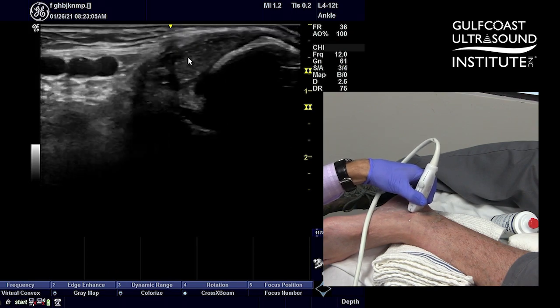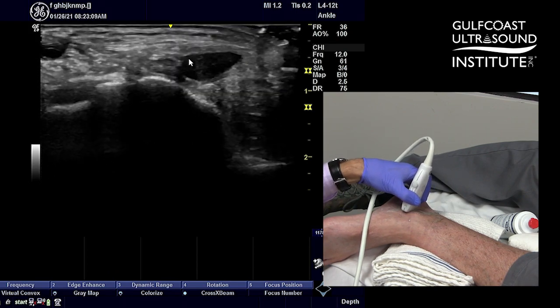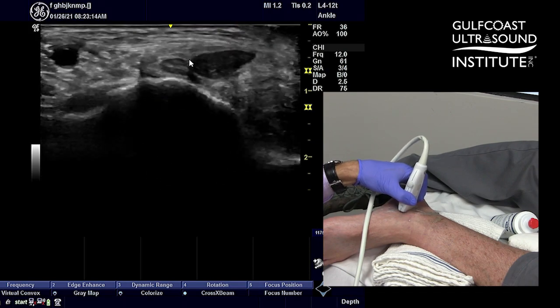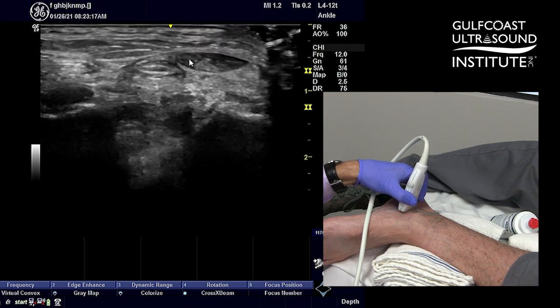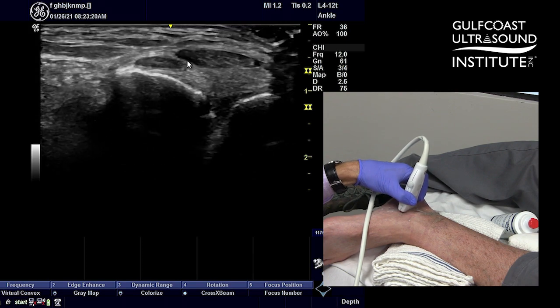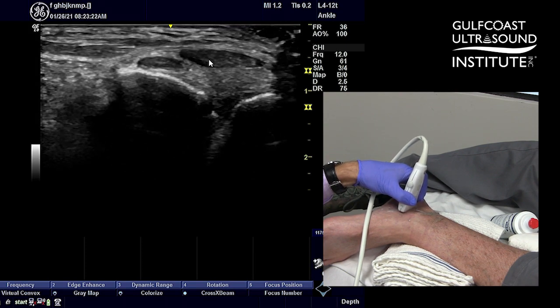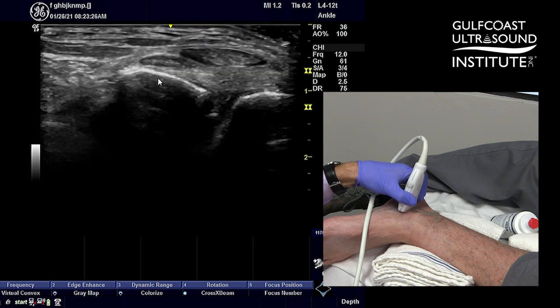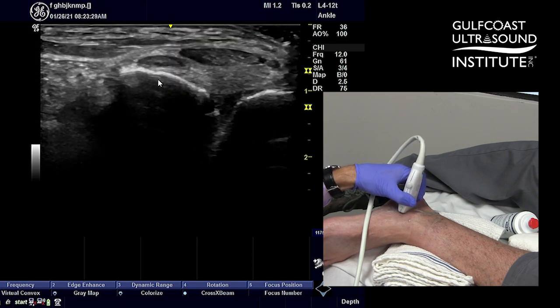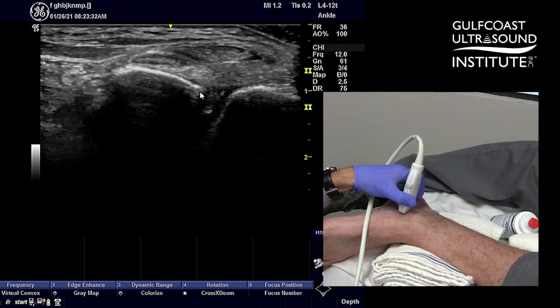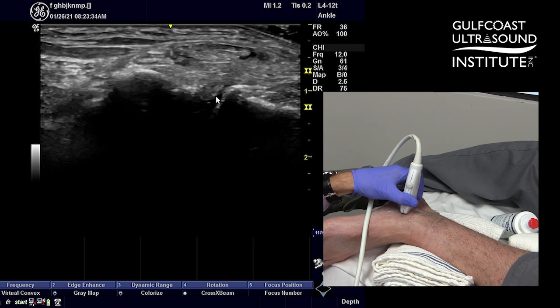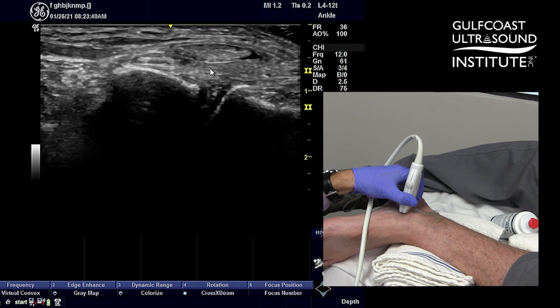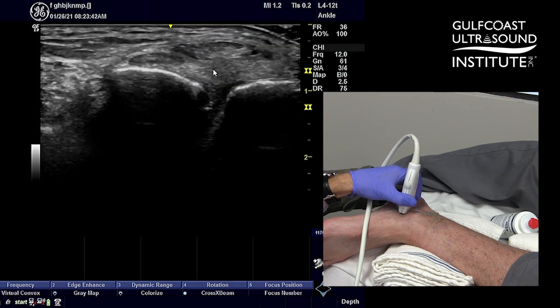Your posterior tibialis, as we slide inferiorly, is going to continue with the FDL. You see some anisotropy here as we're scanning, but as you get down to the inframallular region, you can see the relationship of the FDL sitting on top of the sustentaculum tali noted here. And then just beyond that is the subtalar recess, and then you have this ligamentous structure overlying that just below the posterior tibialis — this is the spring ligament.